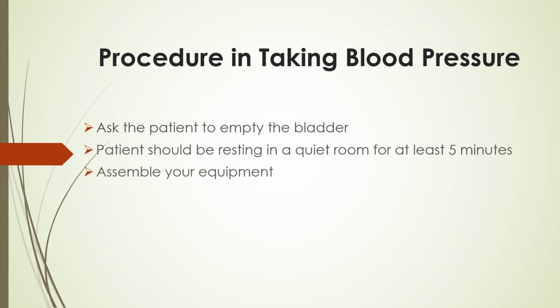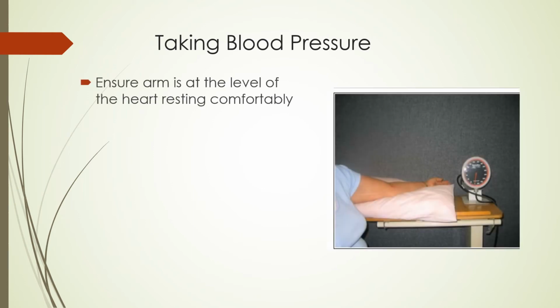You should also assemble your equipment like the stethoscope and the aneroid sphygmomanometer. Wash your hands and sanitize. After doing this, you can begin taking blood pressure. First, you have to ensure the arm is at the level of the heart, resting comfortably.